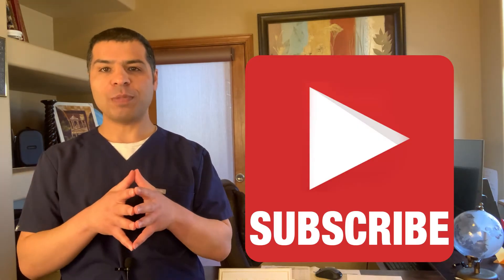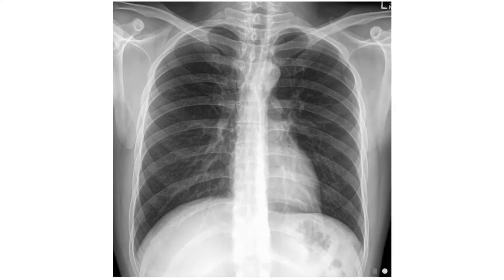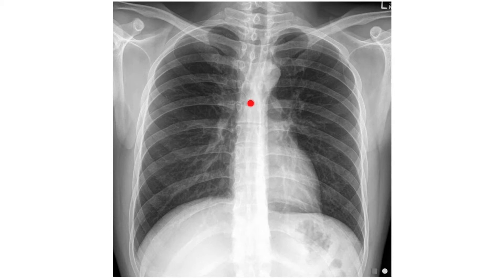The depth of ET tube is always related to the carina. The very first step in determining the right depth of the ET tube is trying to identify the carina — where the right main stem and the left main stem bronchi meet. Sometimes it's very easy, like in this x-ray where there's no ET tube. We can see the left main stem right here, so we can guess the carina will be right here.